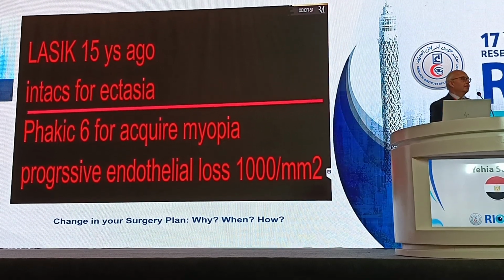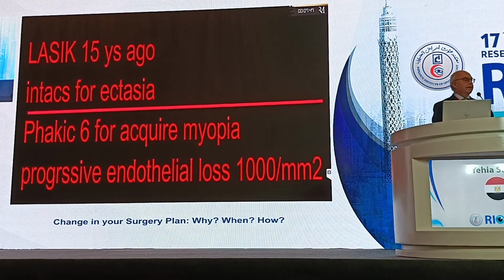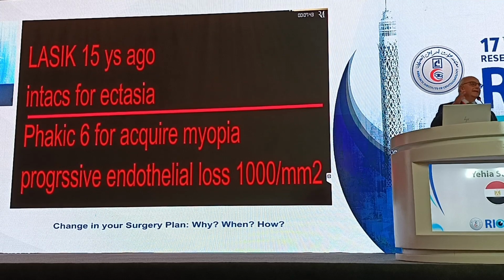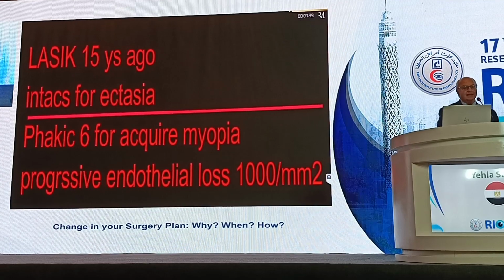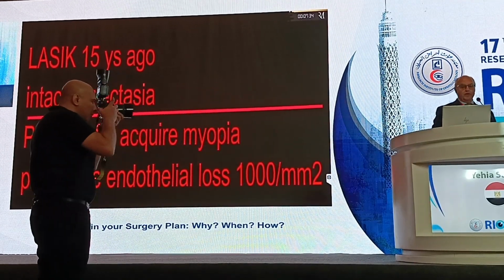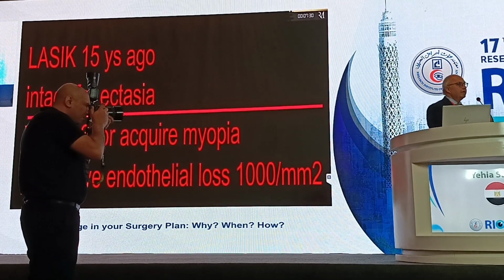Then they did an anterior chamber phakic IOL, A6, phakic 6, which was common in the late 80s and early 90s. This is an anterior chamber phakic lens, and actually these lenses were recalled from the market. So the patient came to me.